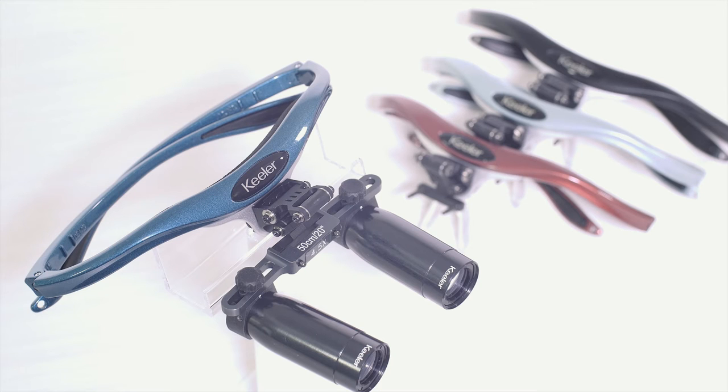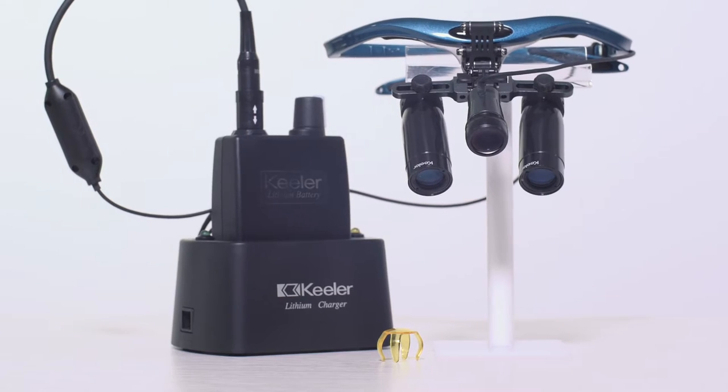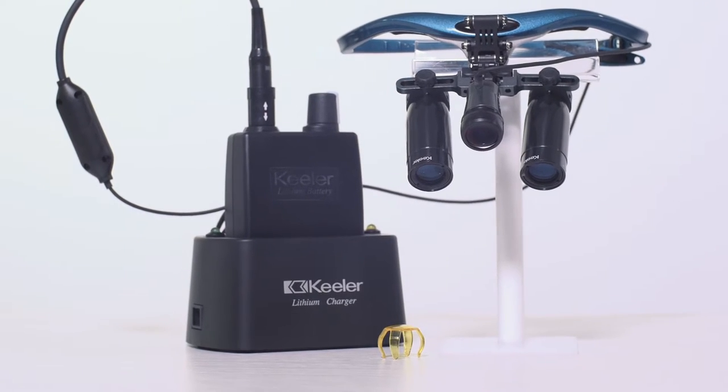All loops are available on our line of colorful sport frames or our headband mounted. This video will provide an overview of the Keeler Loops, Frames and Lighting features and a guide on how to use them.